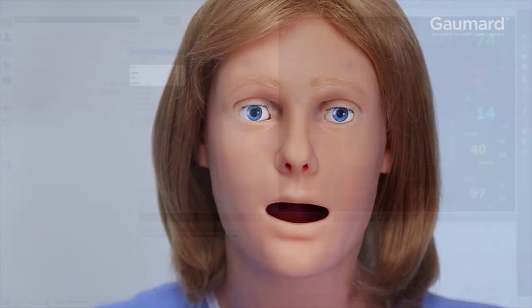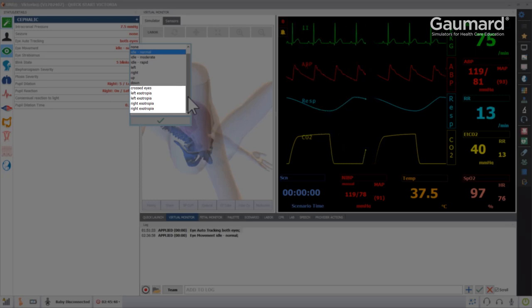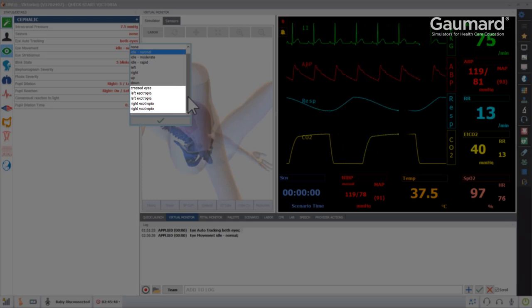You can also demonstrate temporary strabismus by choosing esotropia or exotropia in either eye or crossed eyes from the eye movement list.